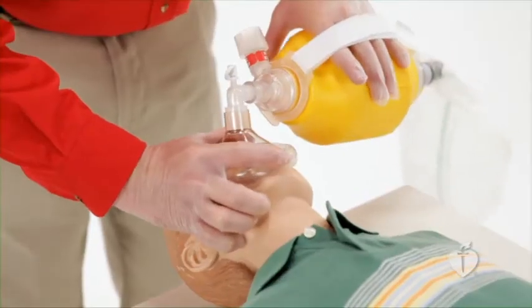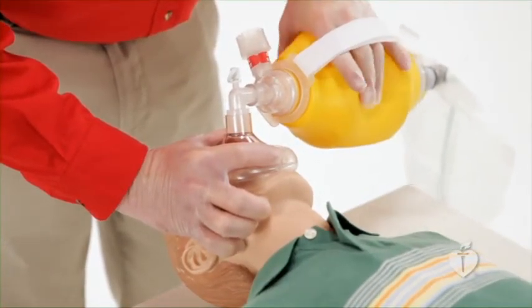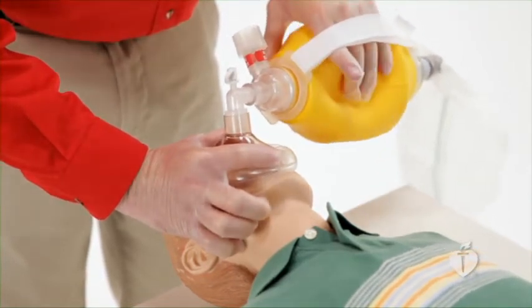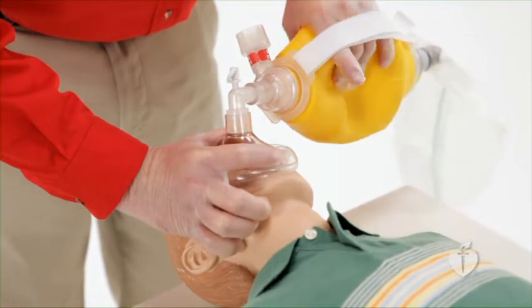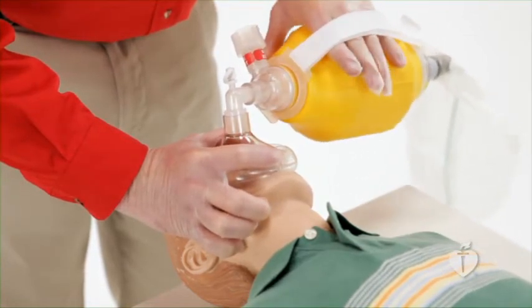If you tilt or extend a child's head beyond the neutral position, the airway may become blocked. Make sure you hold the mask against the face with your thumb and index finger while using the remaining fingers of that hand to lift the jaw and open the airway. Make sure you make a tight seal between the mask and the child's face.